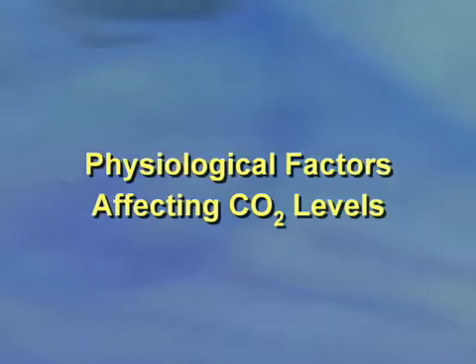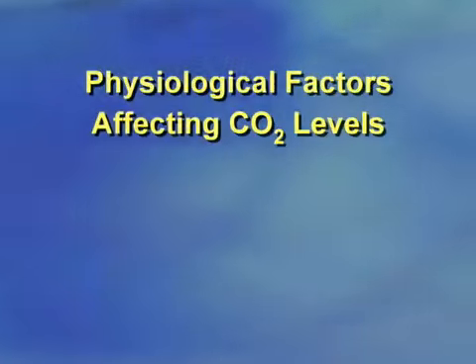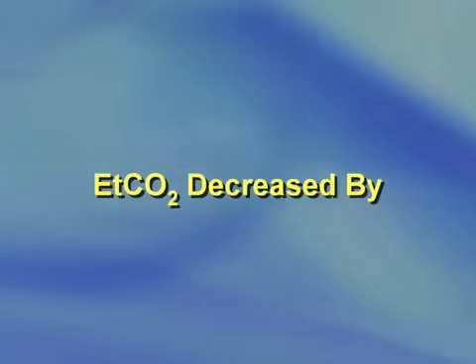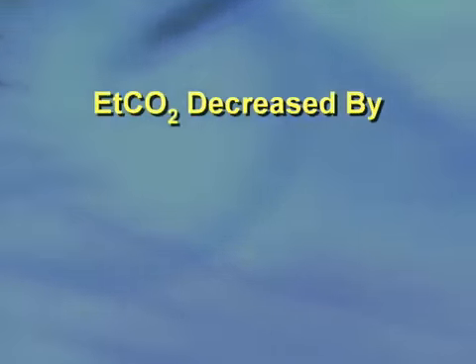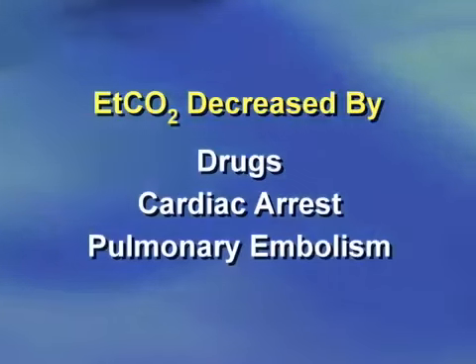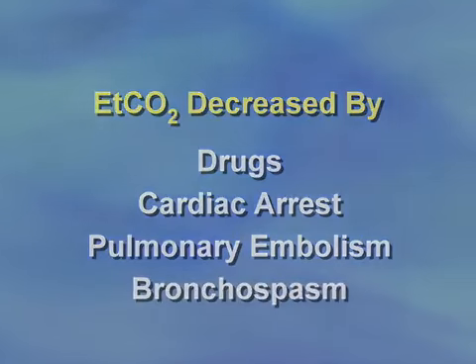Physiological factors that can affect CO2 levels are increased cardiac output during resuscitation and effective treatment of bronchospasm. A decrease in end-tidal CO2 can be caused by drugs, cardiac arrest, pulmonary embolism, and bronchospasm.